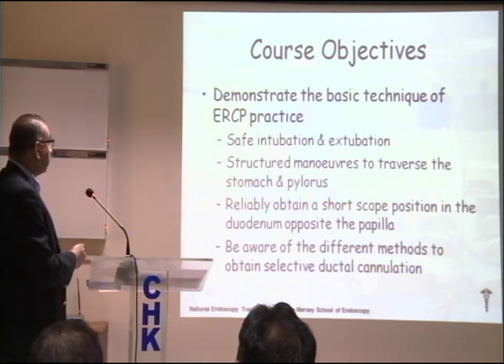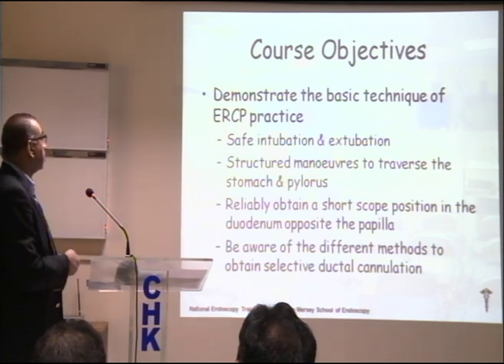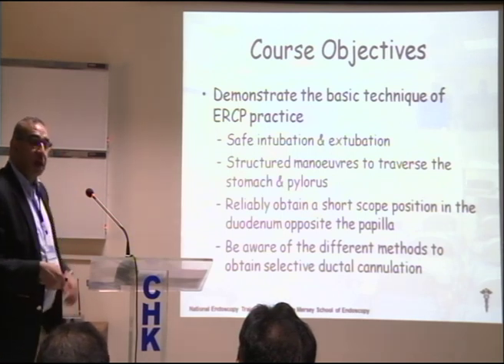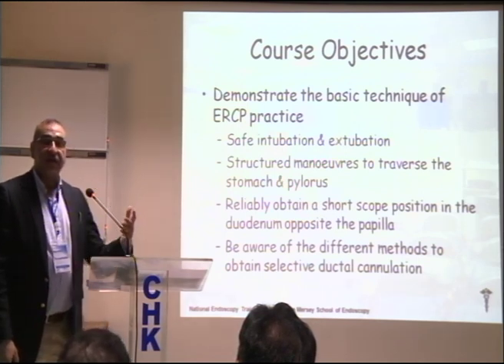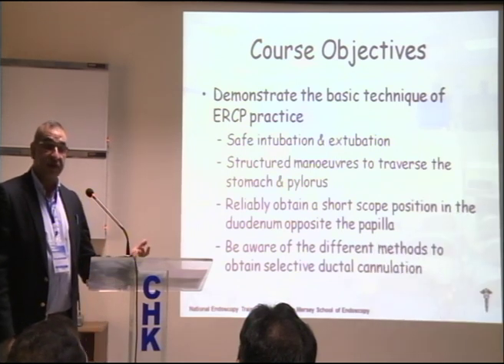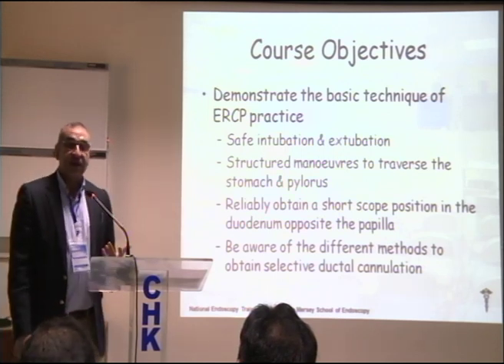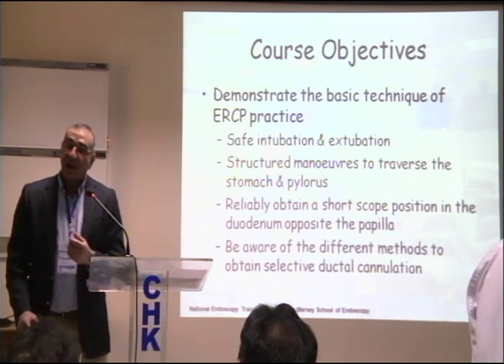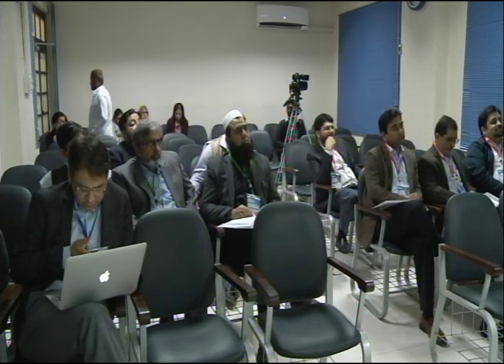So the main thing we will be aiming to do, especially initially on the models and then on the patient, is the safe intubation and extubation of the scope, because that's most important. Once you've intubated the patient, a lot of people get stuck inside the stomach because it's a side viewing scope. It's a different experience. If not used to the ERCP scope, the whole orientation is different. Whenever I teach my trainees, I tell them to try thinking about it as driving your car and watching through the side window, not through the front windscreen. So it is different. You have to reorientate yourself.